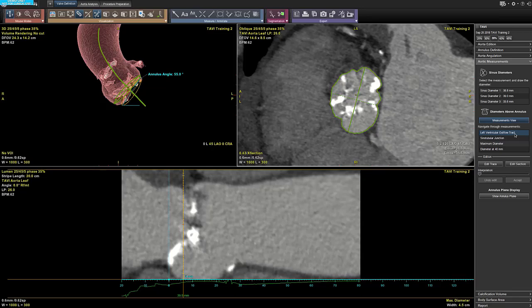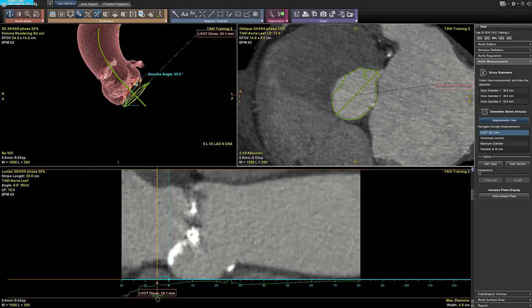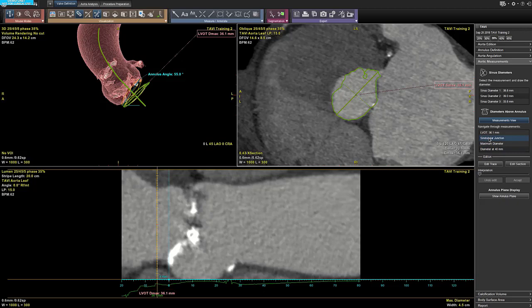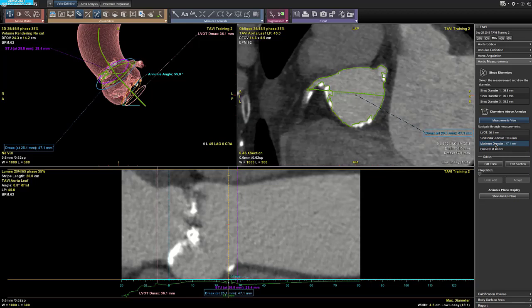You can click on the diameters in the wizard panel, on the left ventricular outflow tract measurement in this example. The measurement is automatically deposited in the lumen view — it is always deposited five millimeters below the annulus plane. The sinotubular junction diameter is the minimum diameter of the vessel between 25 millimeters and 65 millimeters above the annulus. The same is repeated for the other measurements: maximum diameter and the diameter at 40 millimeters.